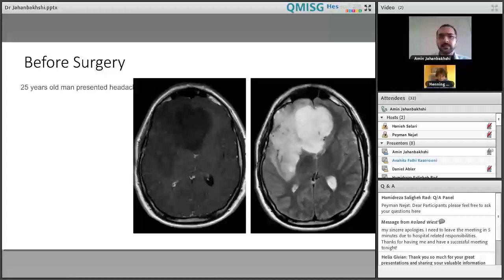It can be a low-grade glioma or something like that, but you can see on the right frontal lobe there are high-intensity lesions that we don't know if it is part of the lesion or it is related to the edema that is correlated to the tumor.